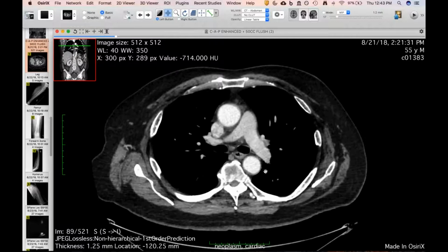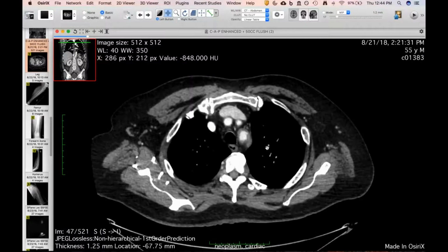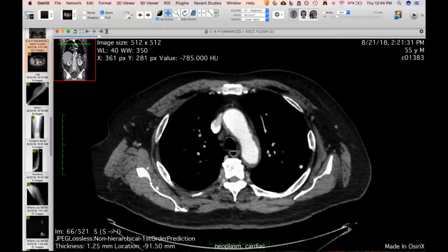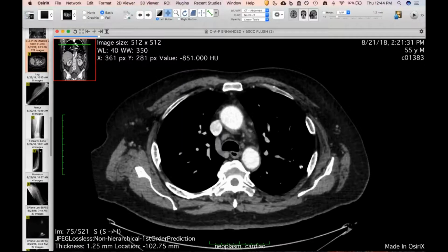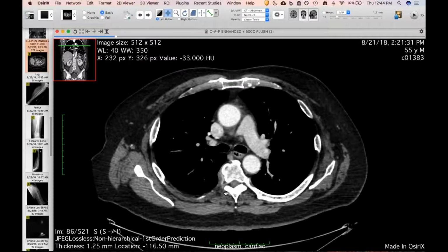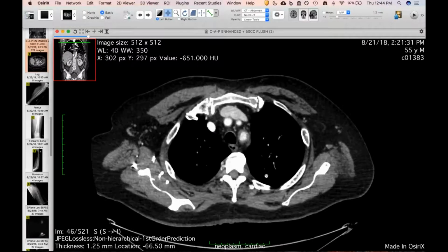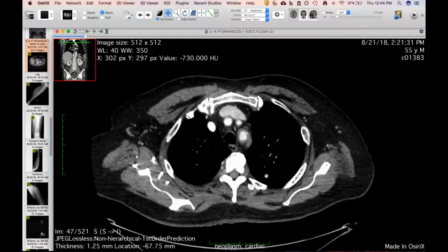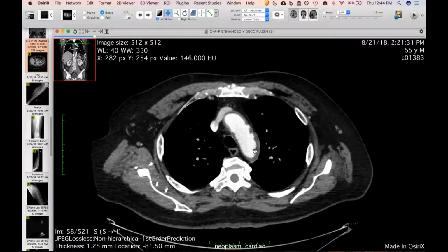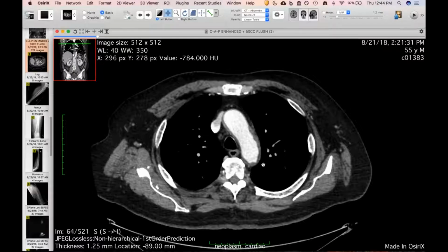I don't know about... How old is he? Most of these times, the guy's in his 70s. He's 55. Really? He's not so healthy. That's the only thing you'd be suspicious about, how ratty his aorta is. Most of it looks like atherosclerosis, but that's a lot for a 55-year-old. Sorry, David, you said something? I think this aorta is probably involved, given his age and given the abdominal findings. That's a lot of wall thickening, and there's not that much calcium. Yeah. The intimal stuff looks more like atherosclerosis, but you're right, the adventitia looks like it may be enhancing. Right.